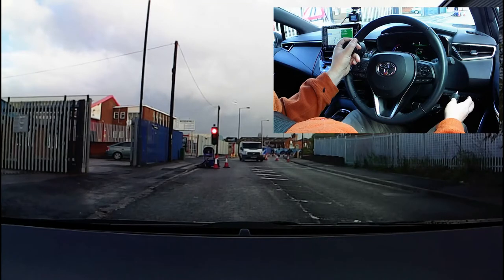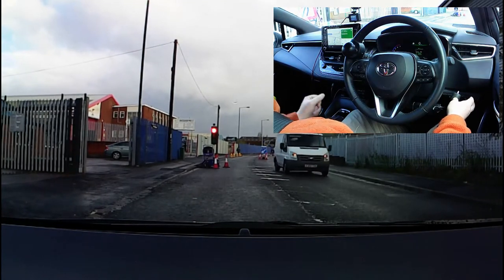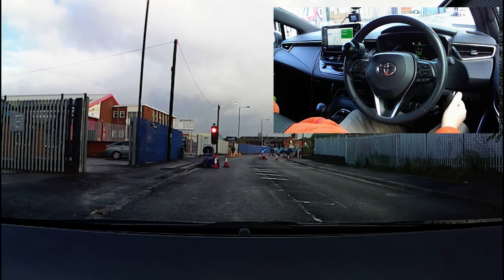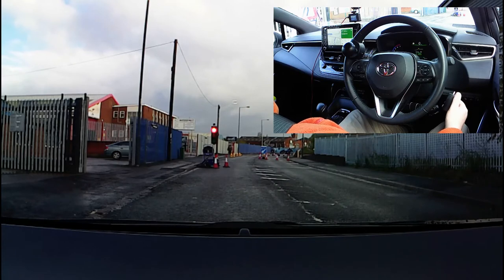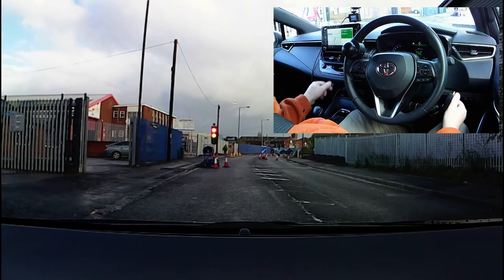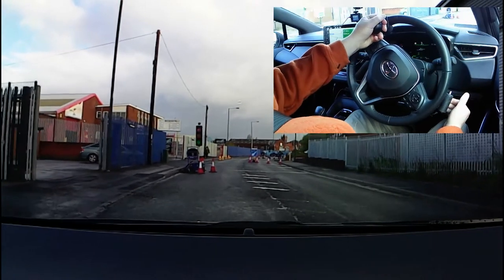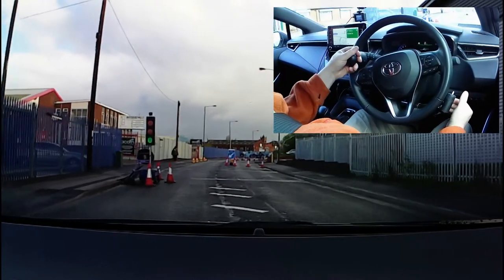While I'm waiting I can either keep my thumb on the brake, or I can select neutral and apply the parking brake and relax my hand for a little bit. When I'm ready to move I'll place the gear selector in drive, pull on the accelerator, and the parking brake in this car will come off automatically.